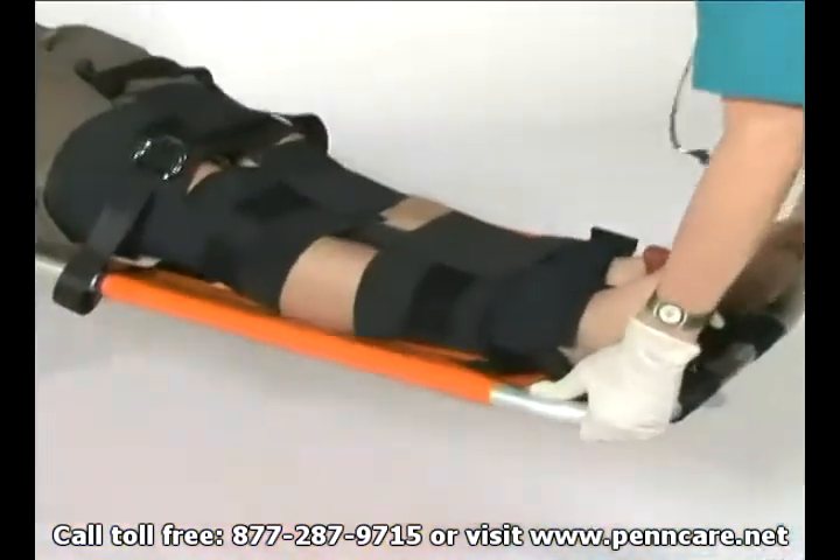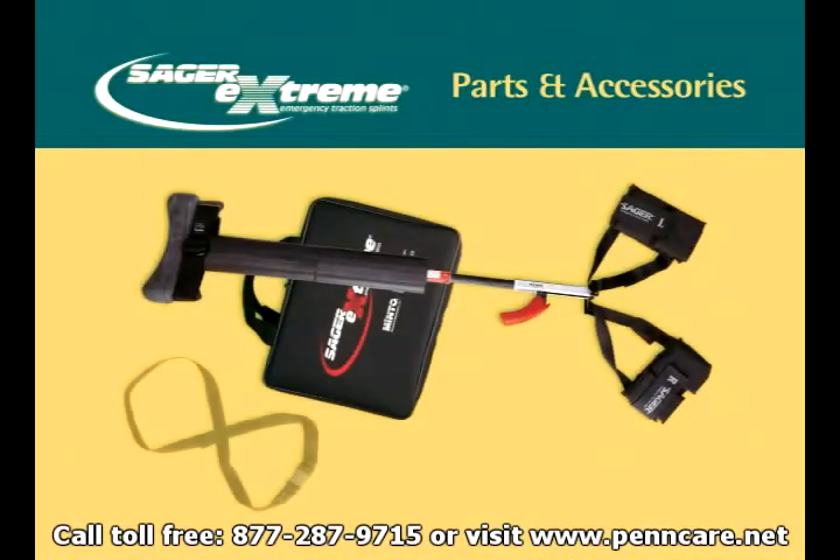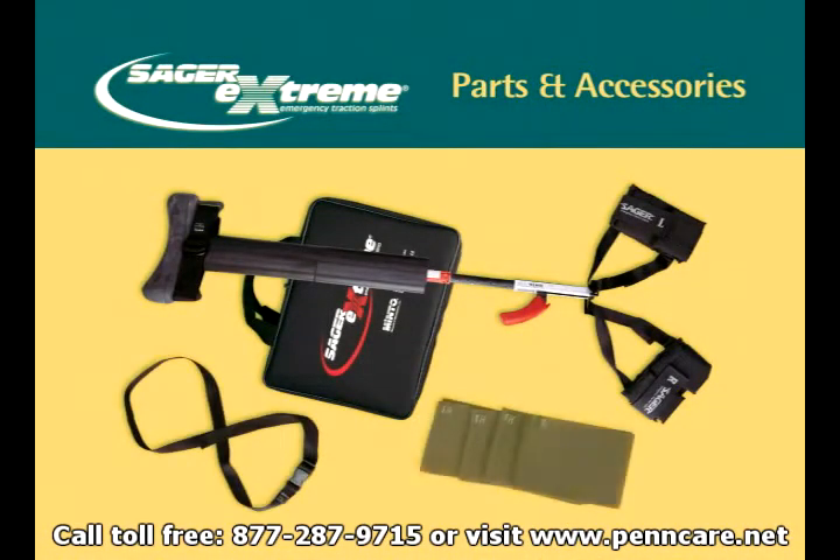The patient is now ready for transport. The SX-404 Sager Extreme comes complete with all accessories required for use: the ischial perineal cushion or saddle, the abductor bridle or thigh strap, the carry case, the splint proper, the leg cravat kit which features four separate lengths, the pedal pinion or figure eight strap, and the malleolar harness set or ankle harness set.